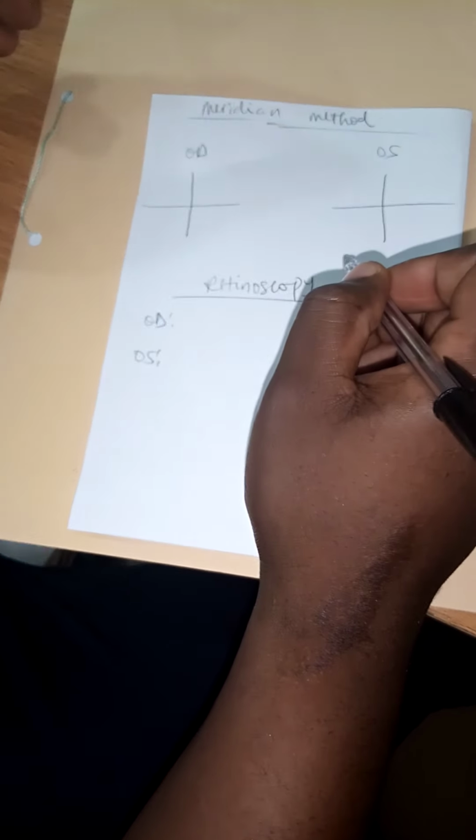Okay, just like during the retinoscopy, we're made to understand that while my streak was vertical and my movement was along the 180, plus 1.50 neutralized the horizontal meridian. So I write it this way. Then, while my streak was horizontal and my movement was along the 90 meridian, or vertical meridian, plus 1 neutralized it for me. The same thing for this left eye as well.